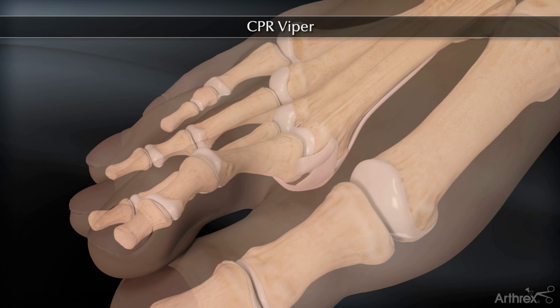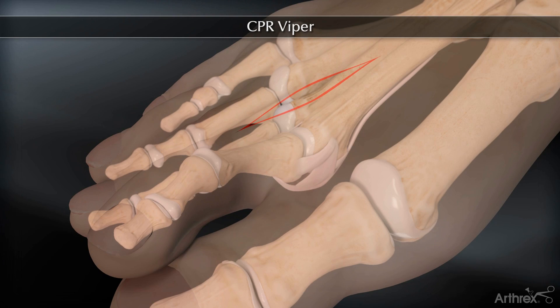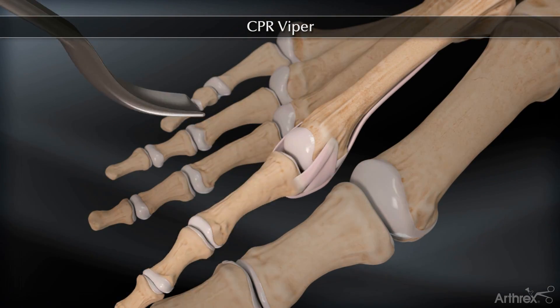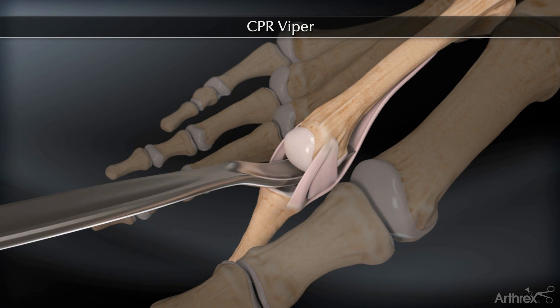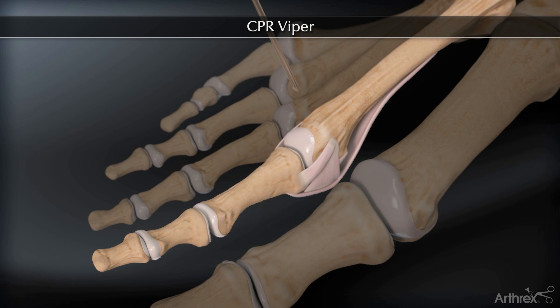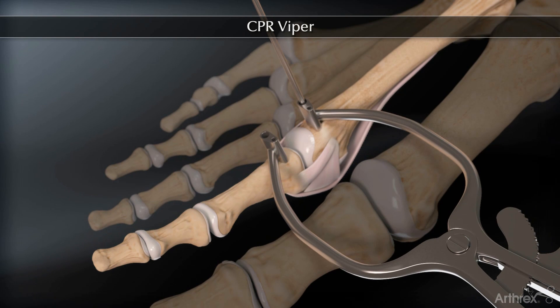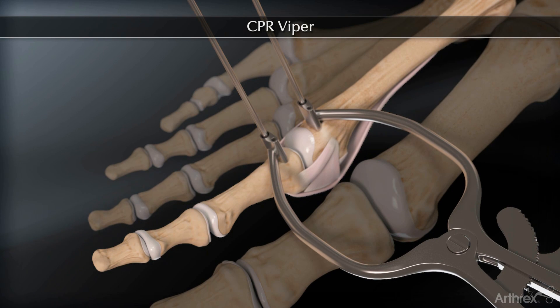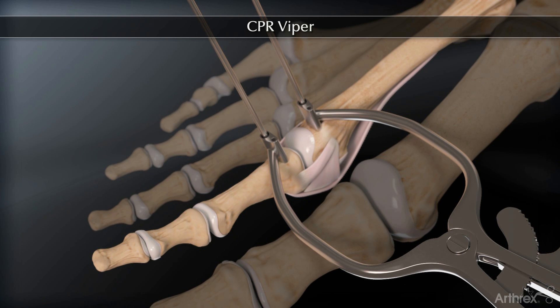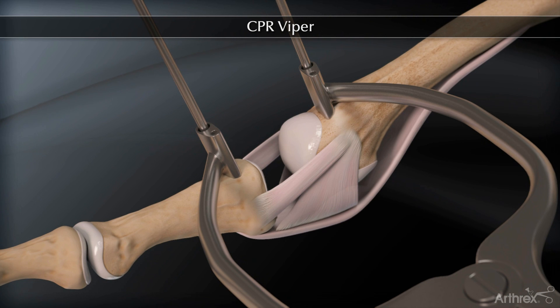A dorsal incision is centered over the second metatarsophalangeal joint. After exposing the soft tissue, the toe is plantar flexed, and a McGlamrey elevator is recommended to aid in the proximal mobilization of the plantar plate. An Arthrex small joint distractor is used to expand the joint. We use either a 1.1 or 1.6 millimeter K-wire to secure the device, and then we open the distractor exposing the plantar plate.